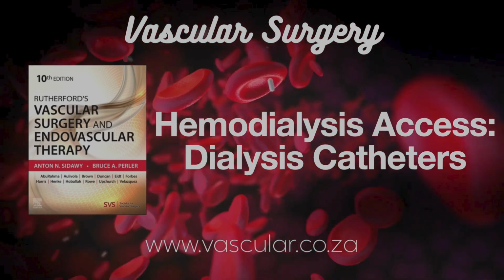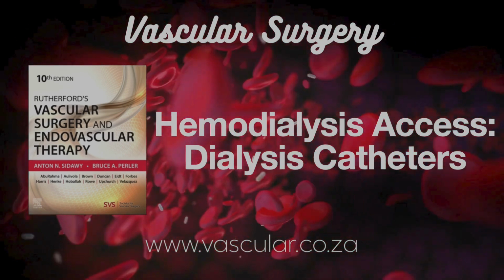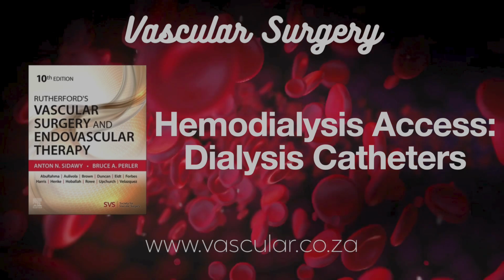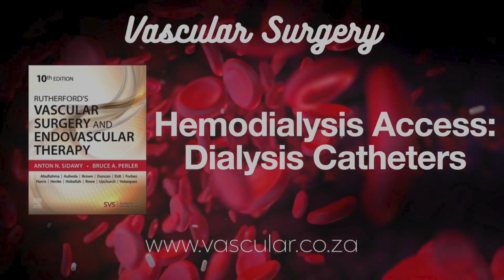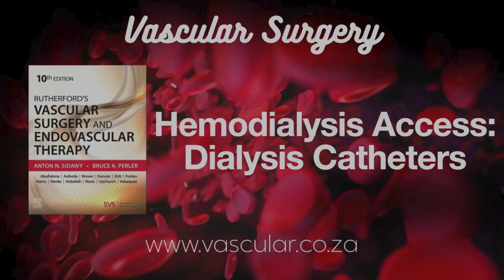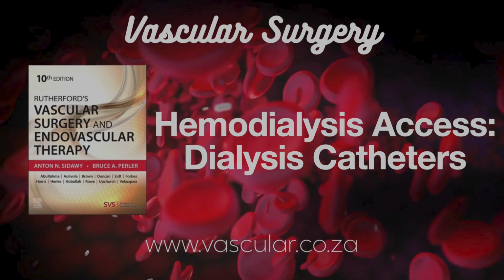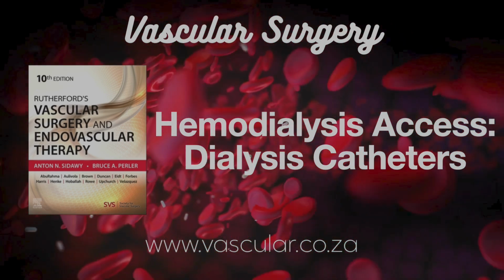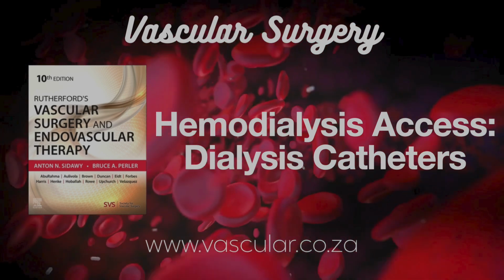Why is avoiding the heart chambers so important? Particularly with left-sided access, the path is more tortuous. If the wire loops inside the heart, the stiff dilator following it could potentially perforate the heart or a major vessel. Using a stiffer wire than the one in the basic kit and watching very carefully under fluoro as the dilators and sheath go in helps prevent that. Sounds like a critical point.